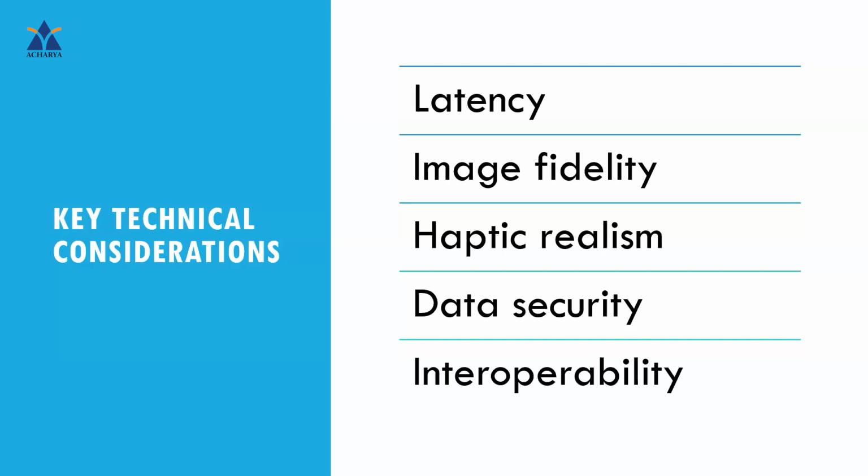Then haptic realism, this is a very significant technical consideration. So you should get the sense of touch. Okay, so providing a realistic tactile feedback is very essential and it requires advanced haptic devices and software. Next is data security and privacy. Just for the sake of using the patient data in simulations, it doesn't mean the data can be misused. So the patient's data has to be protected and it requires security measures and compliance with regulations so that the data is not leaked.